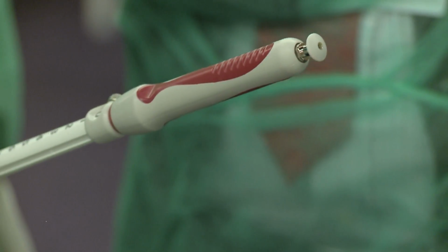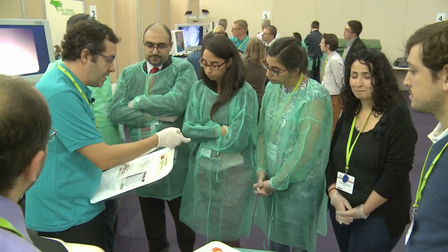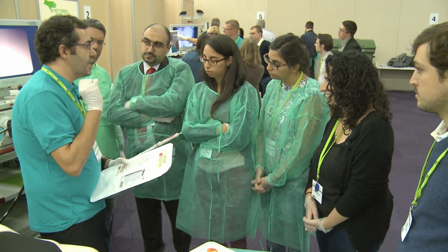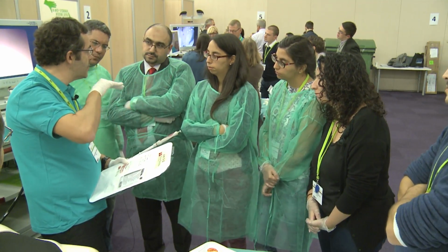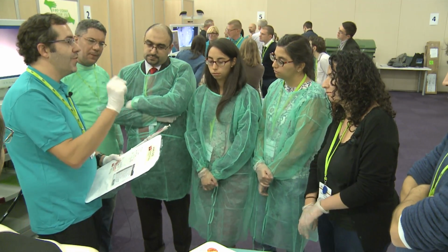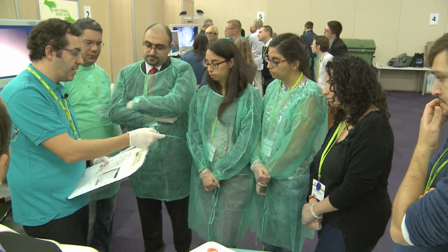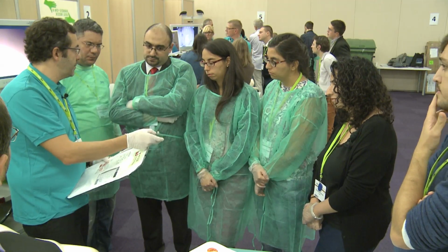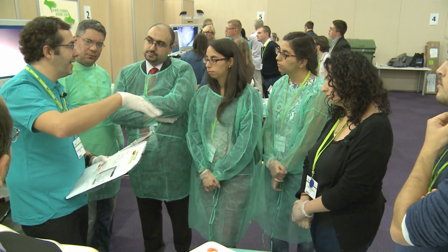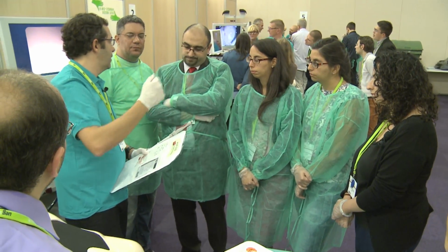For the FNA with the cytological needles, it doesn't matter because there is no side hole, so there is no issue. In that case, you need to pull it up a little bit because the stylet always goes deeper than the needle. So it's better to puncture with the needle, not with the stylet. That's very important. And then there's another point: once you make the puncture with the stylet a little bit up, you push it in to clean the tip of the needle with the stomach wall, duodenum or esophageal cells.